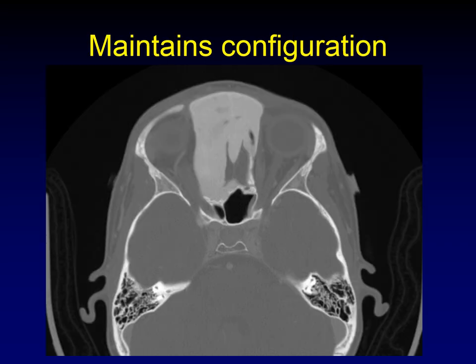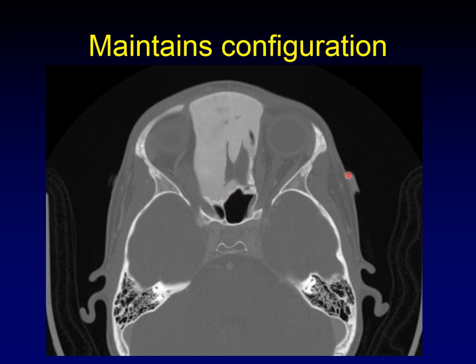One of the important things about fibrous dysplasia is that it maintains the configuration of the underlying bone — this is probably the most important diagnostic clue. Notice that the crista galli is still visible sticking up from the anterior skull base. The lamina papyracea, while incredibly thick, still has the basic shape of the lamina papyracea. Even the anterior wall of the sphenoid sinus retains its shape. So fibrous dysplasia expands a bone but maintains the underlying configuration of that bone.